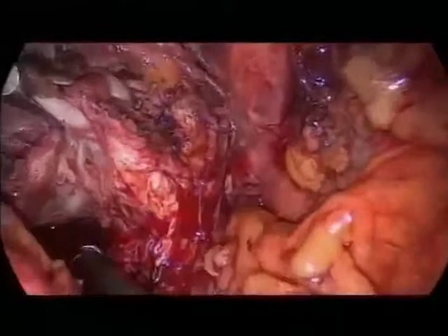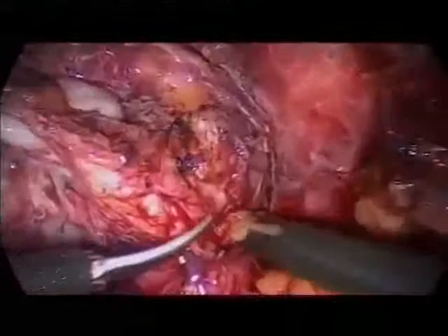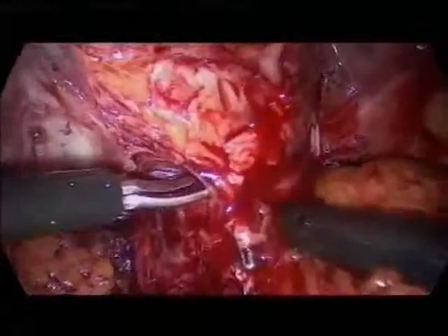I think one important thing is, you know about our retrograde approach, but you have some orientation at least anteriorly by your primary dissection of the periprostatic fascia. So you have a good orientation. That's right, so you don't need to go down to the bundle, because you can already see where the bundle lies below. Absolutely right. And when we can't proceed on one side here, then we go to this side. So we have two sides for orientation. This makes it, in my point of view, easier, or this helps for the orientation.